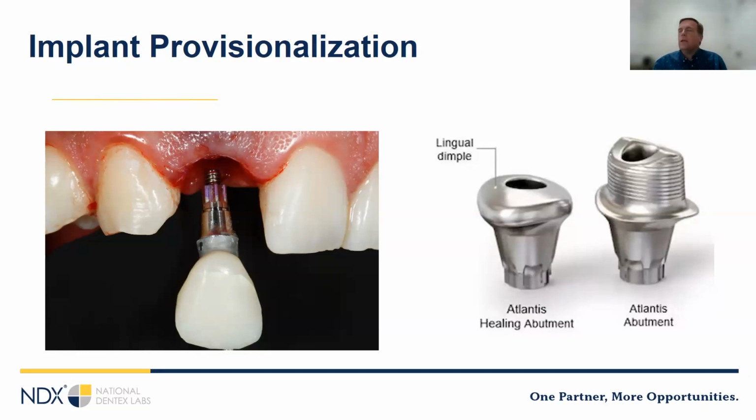When we do custom healing abutments, custom provisionals, whatever, one of the things that was a problem in the past is that then we got to figure out a way to capture it. So then we'd have to take an impression post, put a bunch of resin on it to capture, and that was really a pain. This is where IOS has really shined. With an IOS, you just pull the provisional, scan the tissue for its contours, then put your scan body in there. It really has made, I think, custom tissue management much more viable than it was in the past.